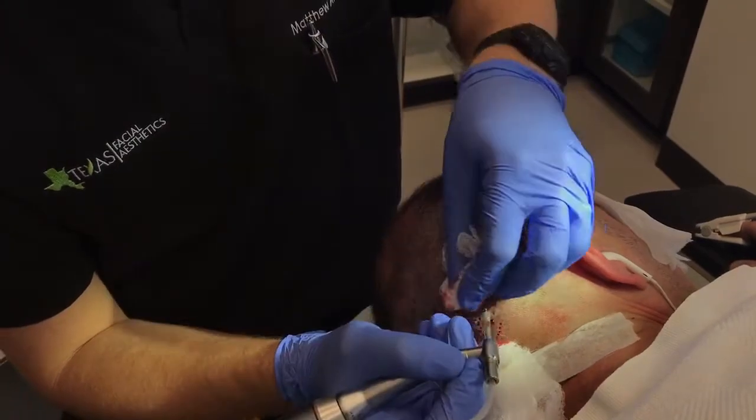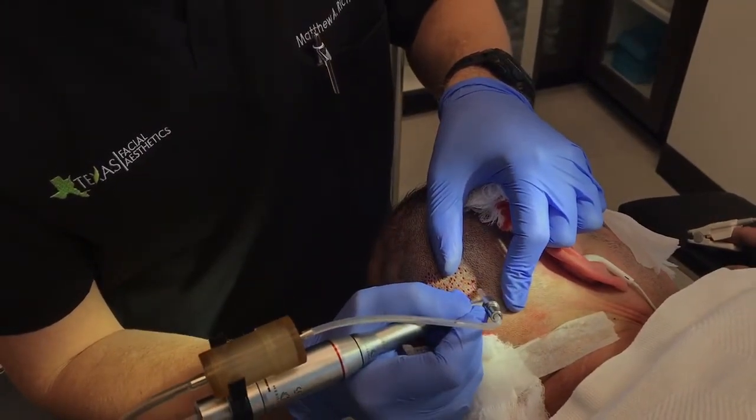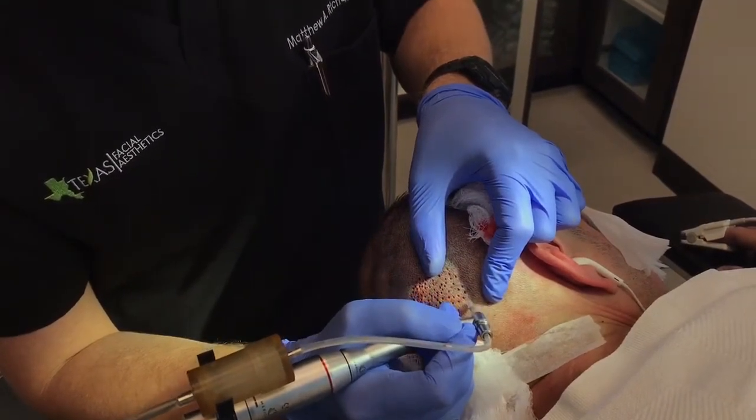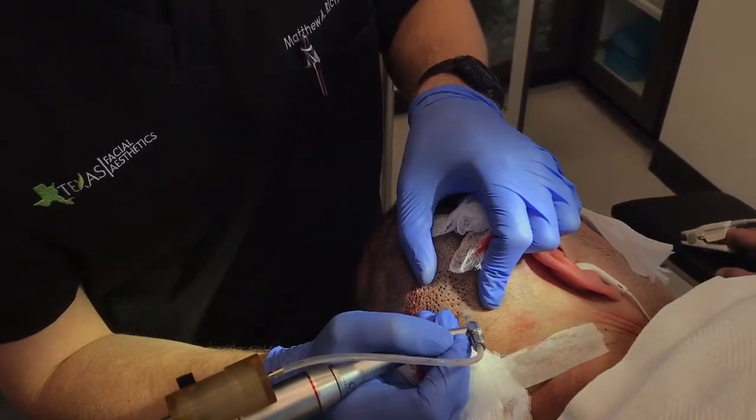The advantage of this technique in this patient is that he likes to wear his hair short, and these little holes on the back of the scalp are going to heal very, very quickly. Within about a week, these donor sites will not be visible.